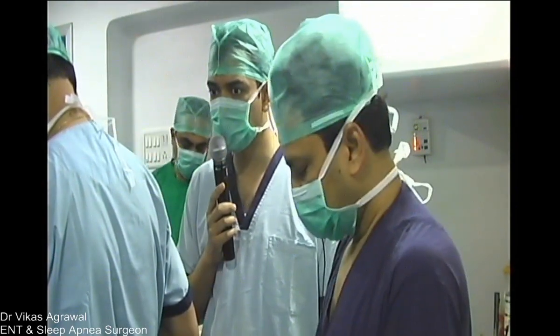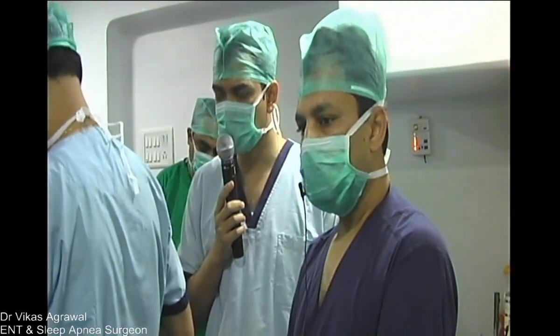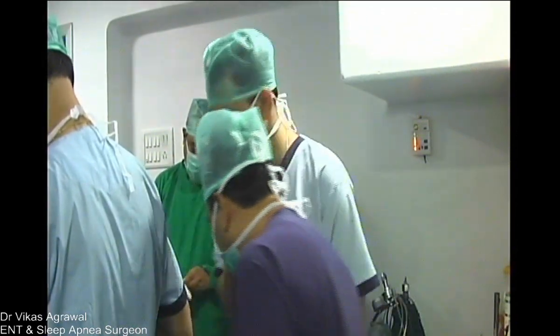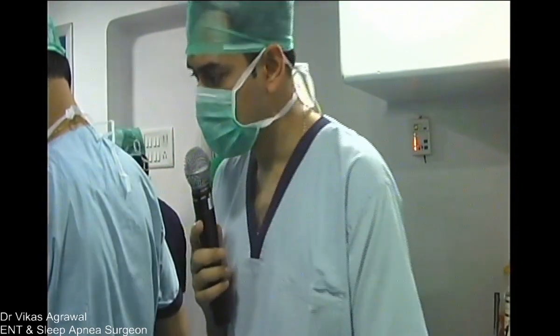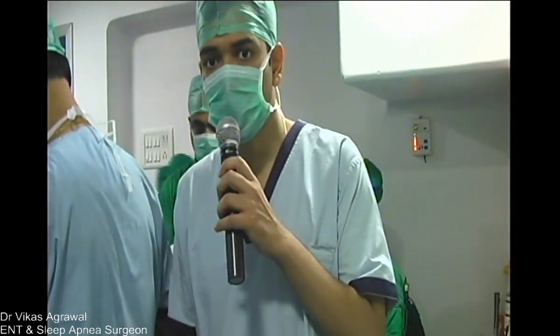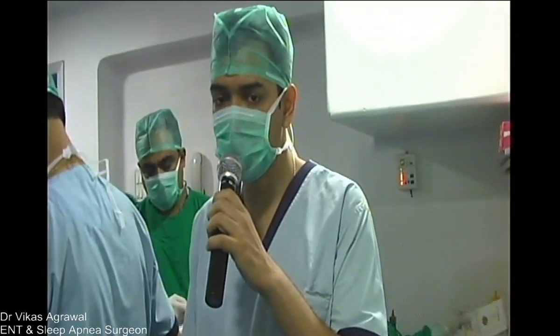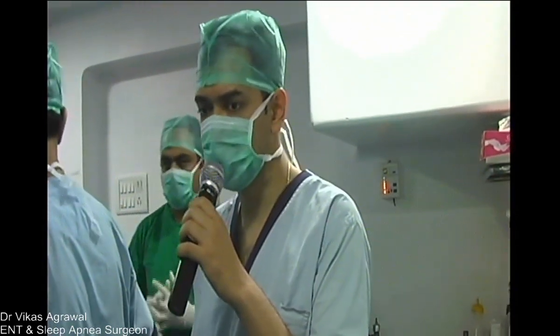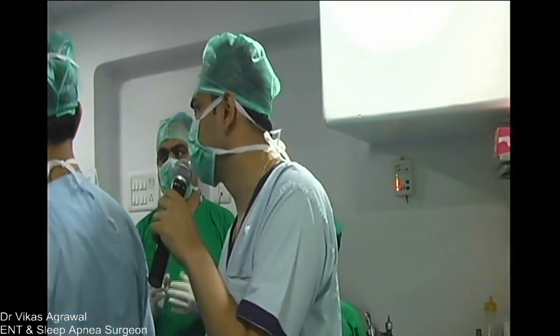And you don't want the patient to be too sedated. So the patient should respond to a sternal rub, should respond to certain physical maneuvers, but should not respond to verbal stimuli. That is the key here, to establish that level and to maintain that level. So the challenge has been to find the perfect drug for that. Have we had the discussion for the drugs for sleep endoscopy?